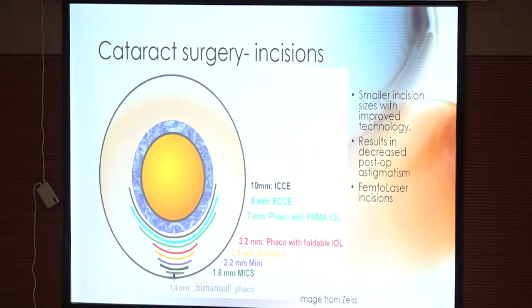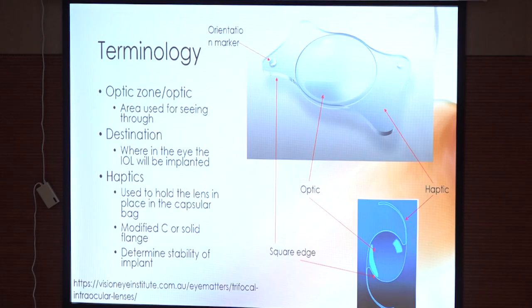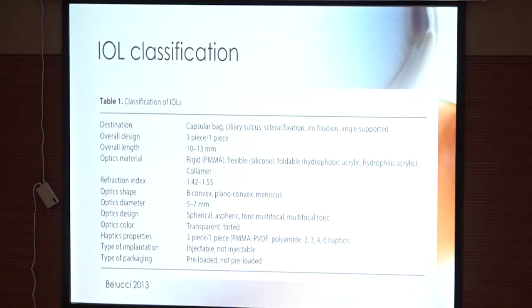We are encountering smaller incision sizes with improved technology, and this results in decreased post-operative astigmatism. And now we have the femtosecond laser also to make incisions which are highly accurate. So we describe the terminology. The central portion is the optic portion, this portion.